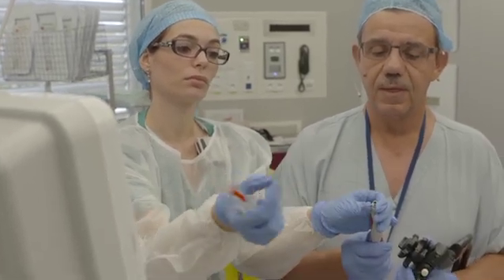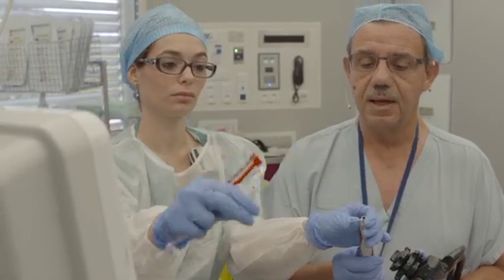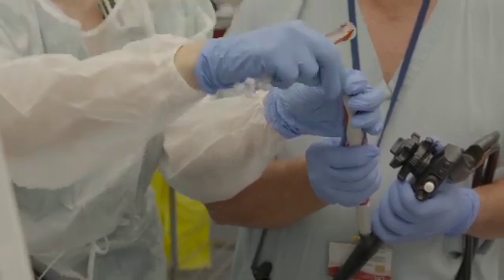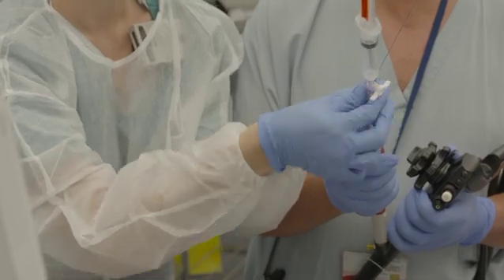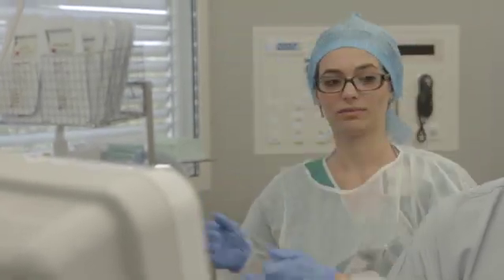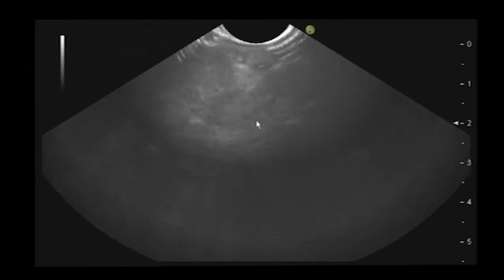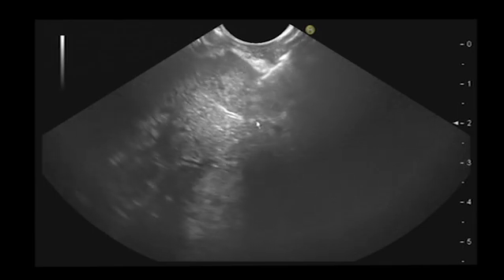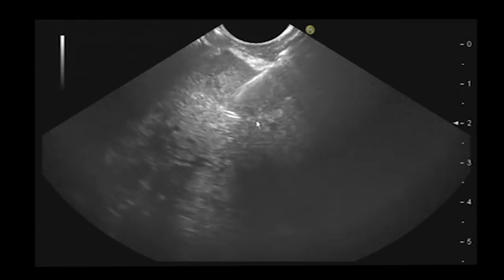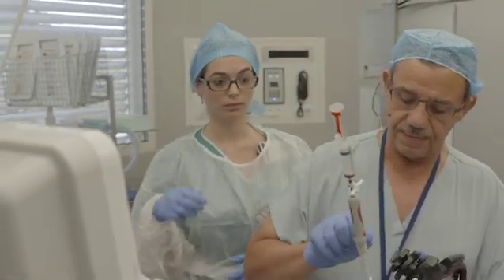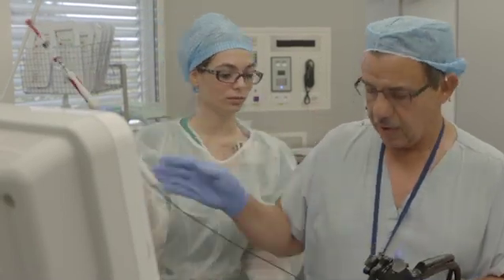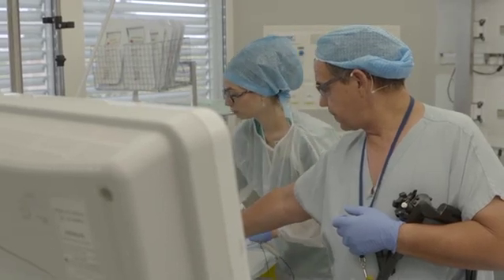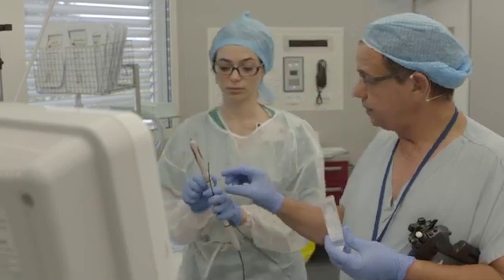Now it's a new stylet — you see, it's in nitinol. Is it much easier? Yes. Now I perform the biopsy of this metastasis. You see the visibility of the needle is very good. With three or four back-and-forth passes, it's enough. We will see the results on the cytolyte. Needle out.